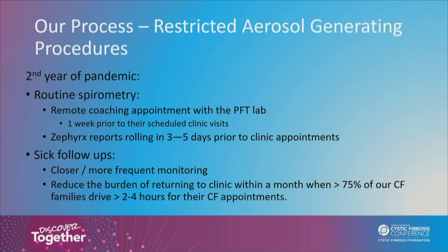We also opted to use this for sick follow-ups. We thought this was a great tool to have closer and more frequent monitoring of our patients without having them physically having to return to clinic. I'm very sure that our clinic is not unique in the fact that the majority of our patients drive a very long distance to come to their clinic appointments. We looked years ago, and statistically, it was over 75% of our patients have to drive at least 2 hours, many of them 3 and 4 hours, just to come to Augusta for their clinic appointments. So we thought this was a fabulous tool to try to keep closer track of their health, especially when they were sick, and relieve that burden of having them physically come into clinic.